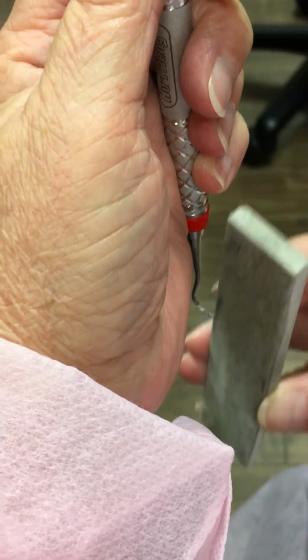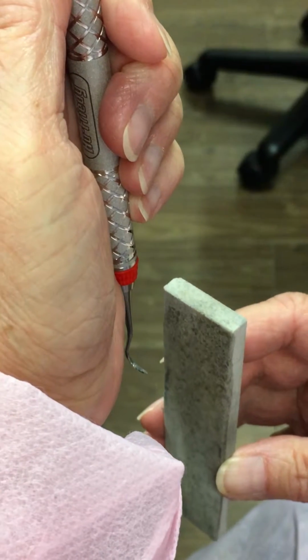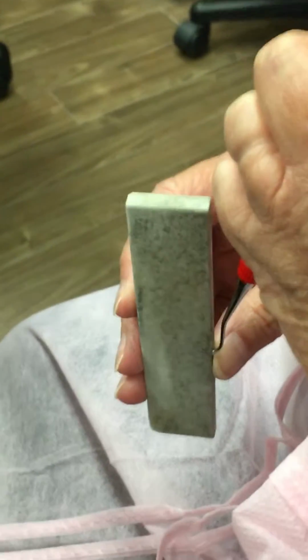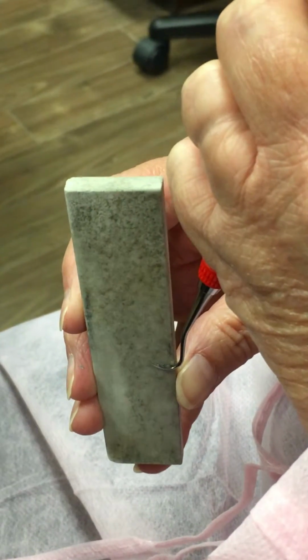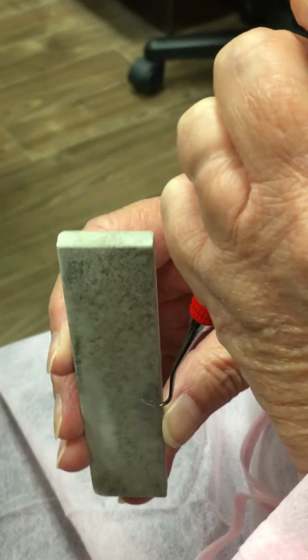This is a double-sided instrument, so I'm going to turn it. Notice I had the toe toward me, and now I'm going to turn it with the toe away. Now I'm going to have to hold it down so I can see over it. I'm going to start at the back, start at 90, open to 110, and you just do as many strokes. Hear that high pitch? So that's sharp.